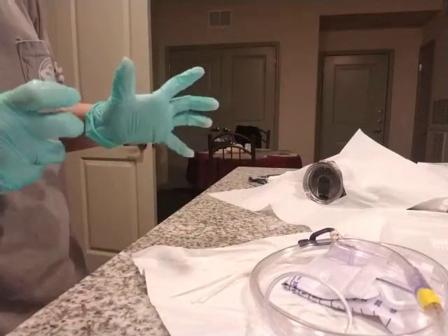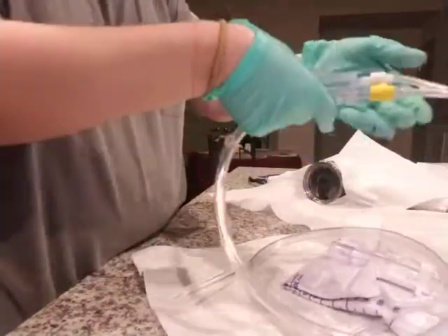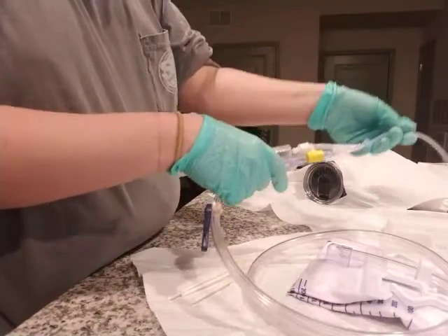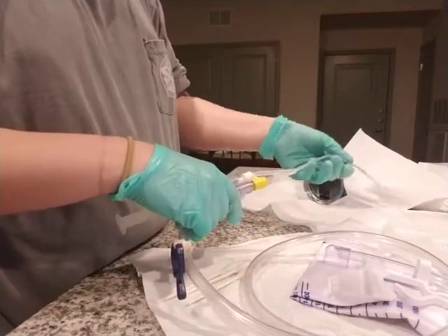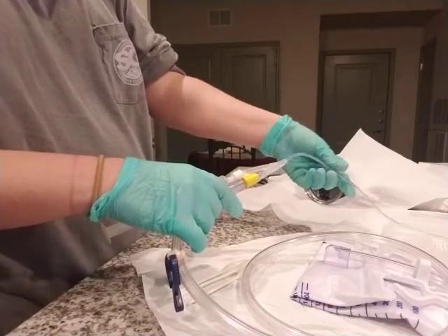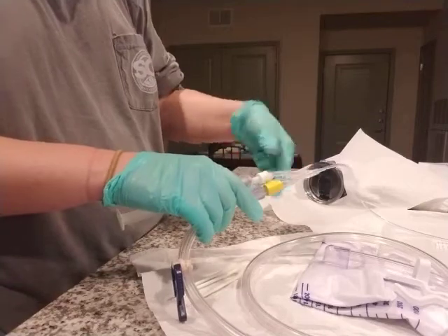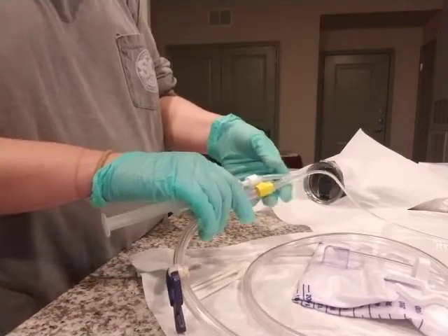Allow that to dry, and then I'm going to grab the catheter, roll the catheter in the lubricating jelly, and I'm going to be inserting this 7 to 9 inches inside the male through the shaft of the penis.